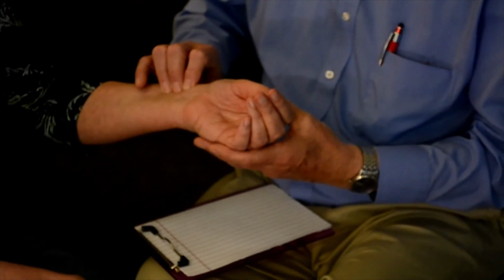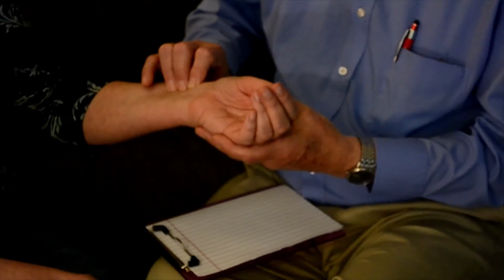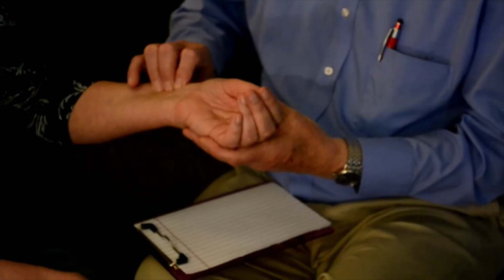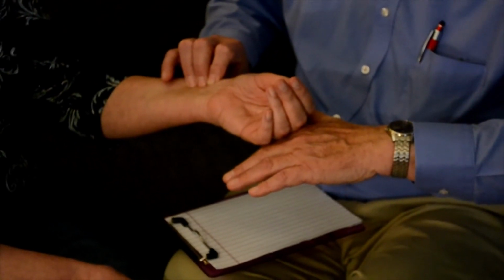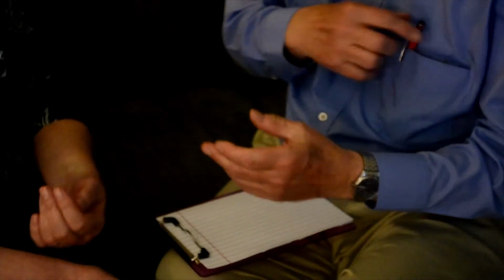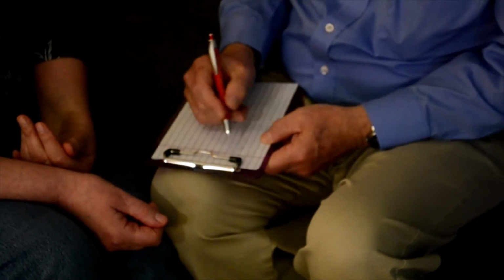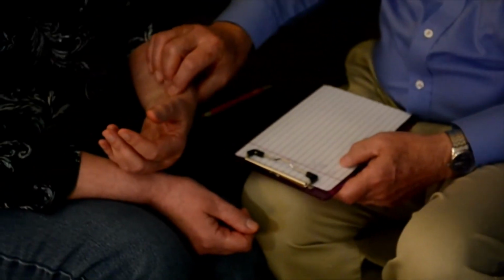To write it down though, I need to multiply that times 2, because we want to know what the pulse per minute is, not per second. So in this case, it looks like you have a pulse of right about 65. So I'm going to write that down. Pulse 65.